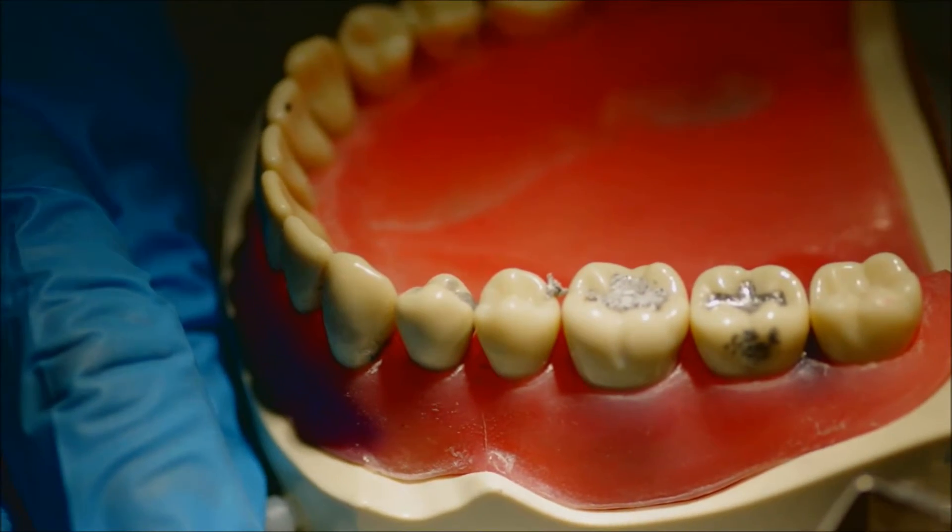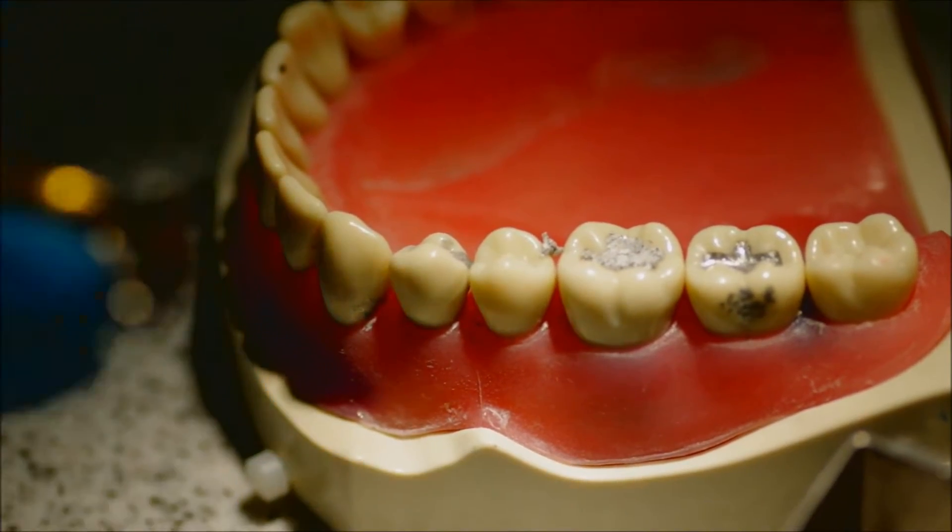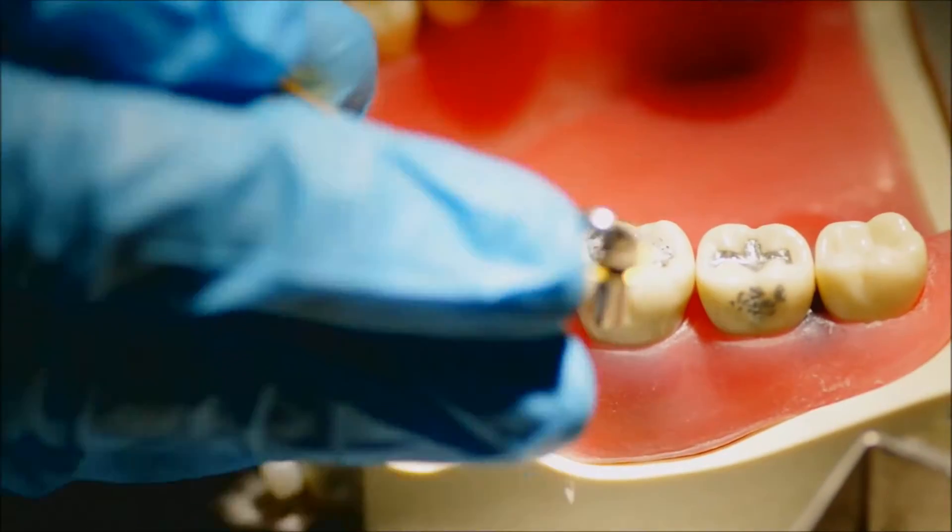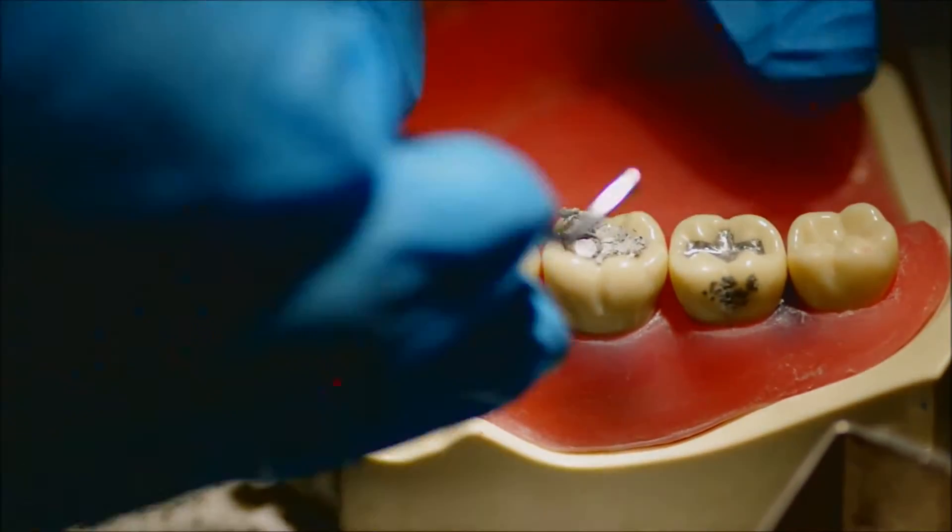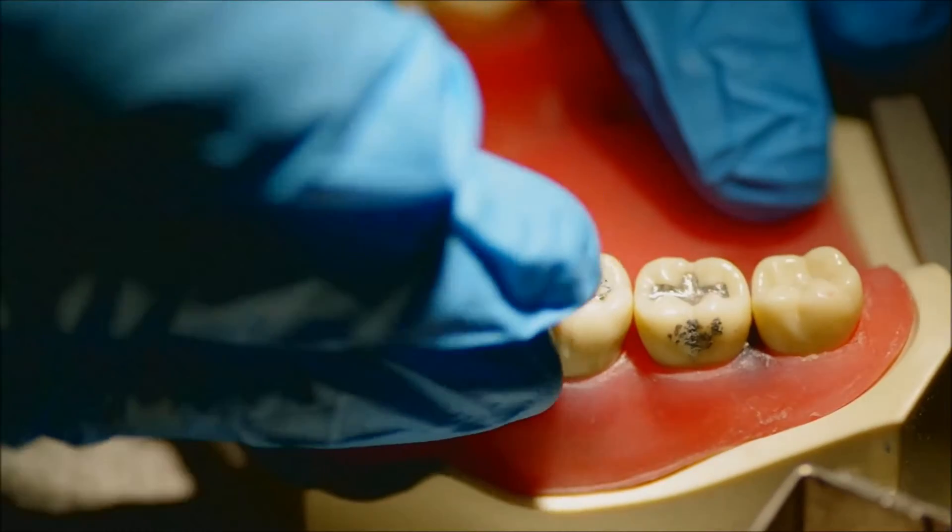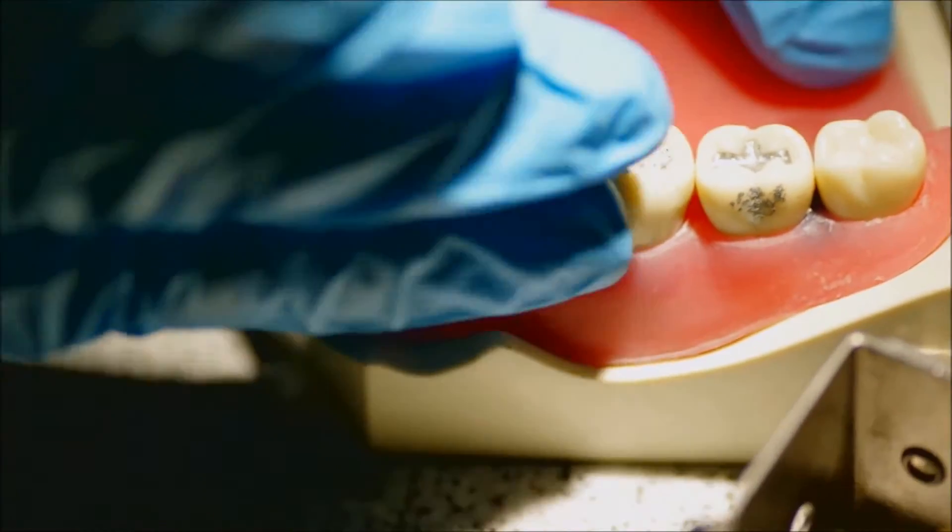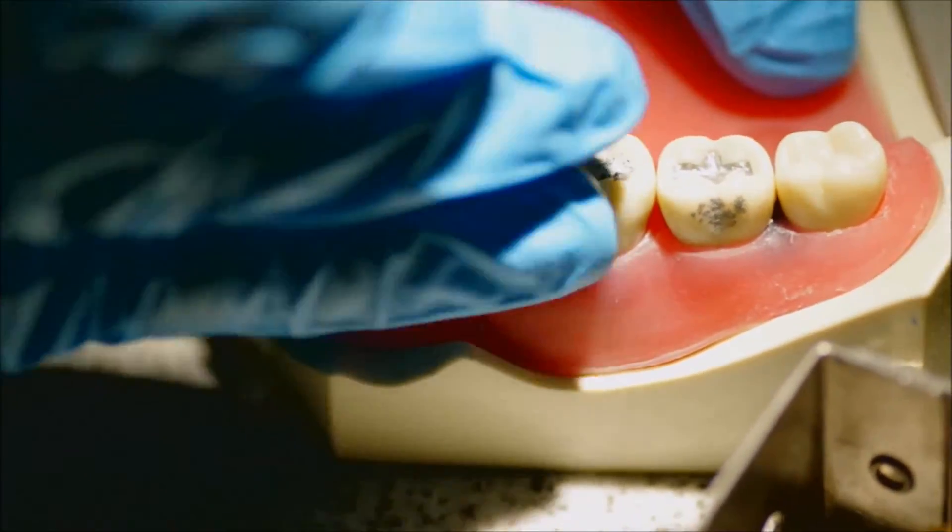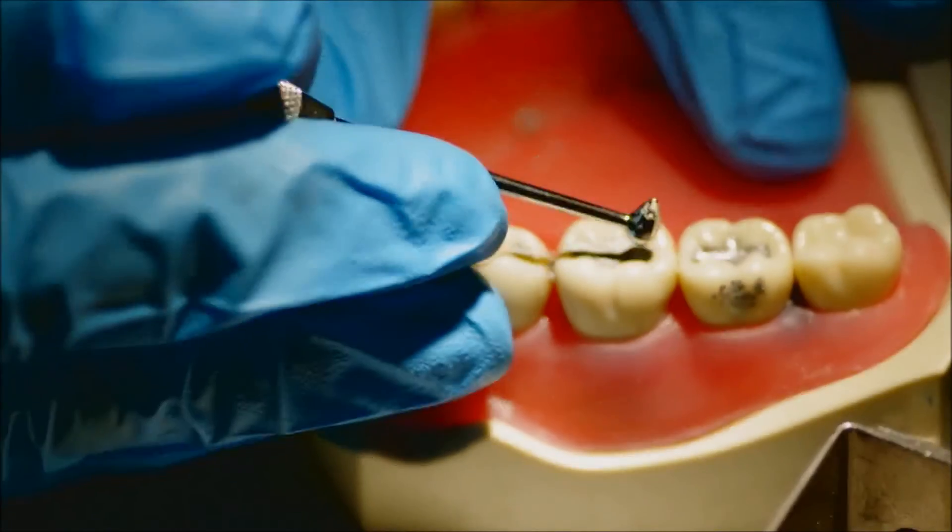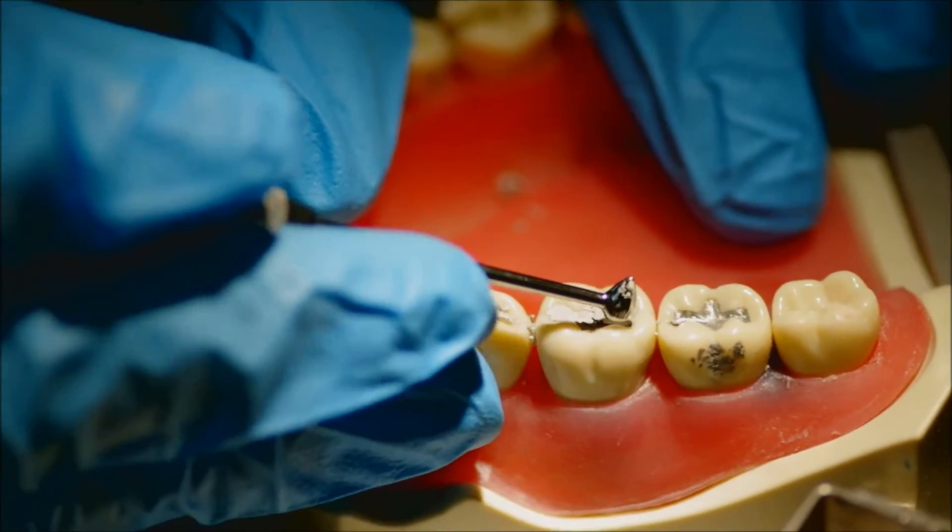At this point, you can see that the amalgam has definitely filled or overfilled my prep, and that's exactly what you need because you need more in order to carve it down to the shape that you require. So again, I put in some more, and I pressed it down with my large condenser.